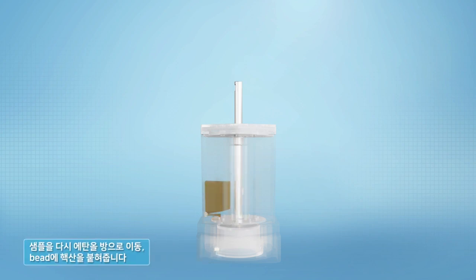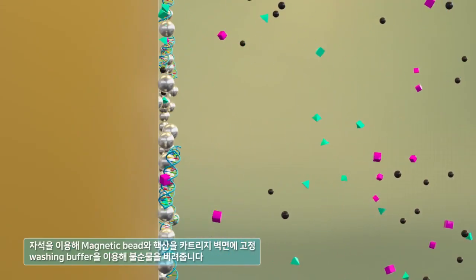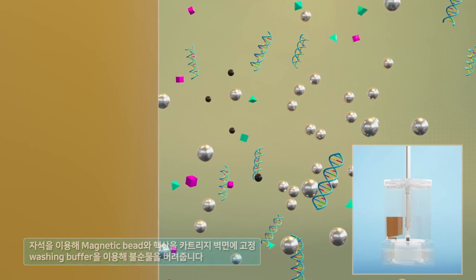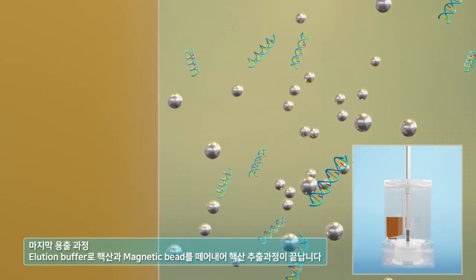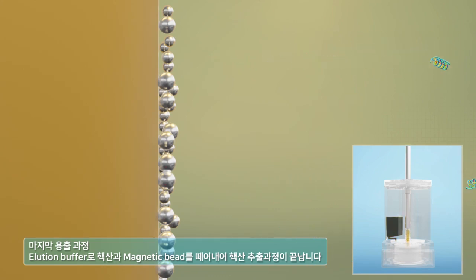Move the sample back to the ethanol chamber with magnetic beads and attach the nucleic acid to the beads. Fix the magnetic bead and nucleic acid to the cartridge wall using a magnet and discard impurities with washing buffer. Repeat this washing process once more to leave pure nucleic acid. Complete the nucleic acid extraction process by removing the magnetic bead from the nucleic acid with elution buffer through final elution.